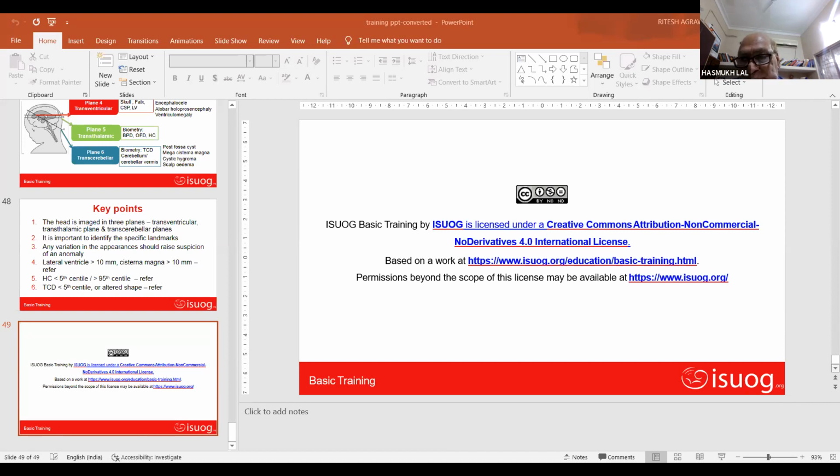Yes, absolutely right. The standard charts are available on the internet and in all textbooks, and the applications expert puts in that data. It takes them no more than 45 minutes to finish this whole chart, and it automatically gets programmed. Even the vascular indices also have their charts. The pulsatility index, and flow. Absolutely. All the Doppler indices of all the major vessels that we use for our growth restriction evaluation, as well as for preeclampsia prediction, have the centiles all put in.